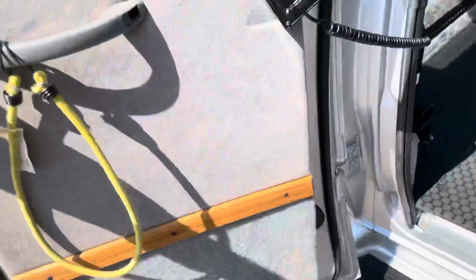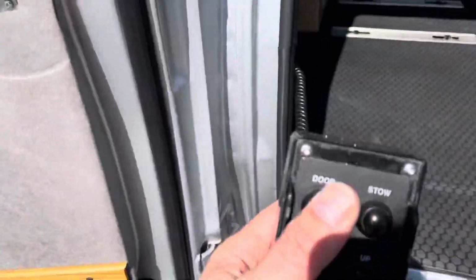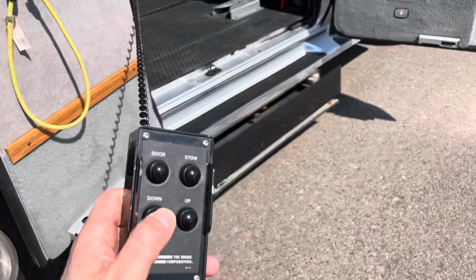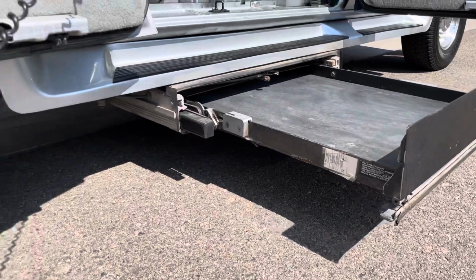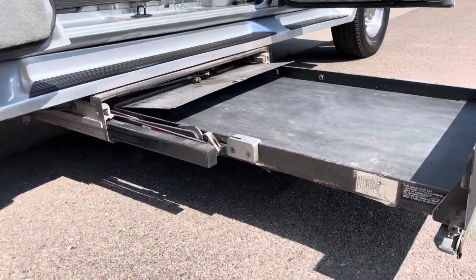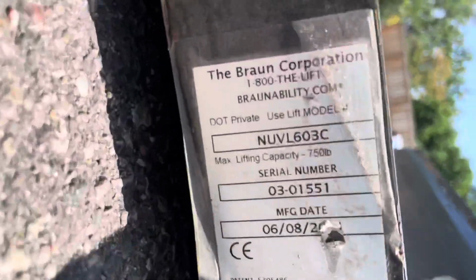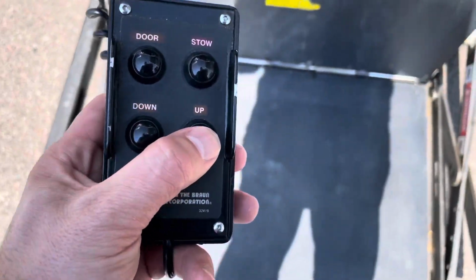The parking brake is on, and then we have the Braun UVL lift system here. Make sure that's on, and then we have the controller right here. So we're going to go ahead and bring that lift down. And that's going to activate the lift here. As you can see, it's an undermount lift in a cassette style tray that comes out. We have 750 pound capacity.